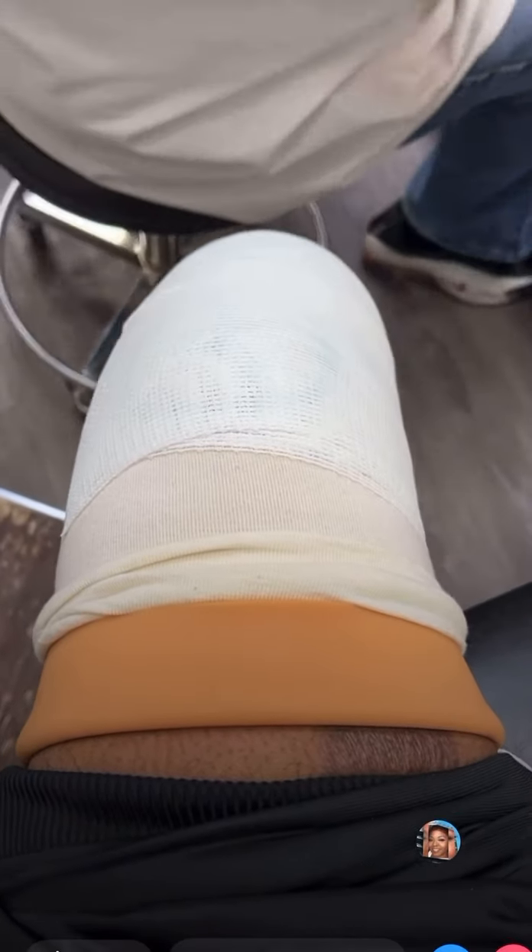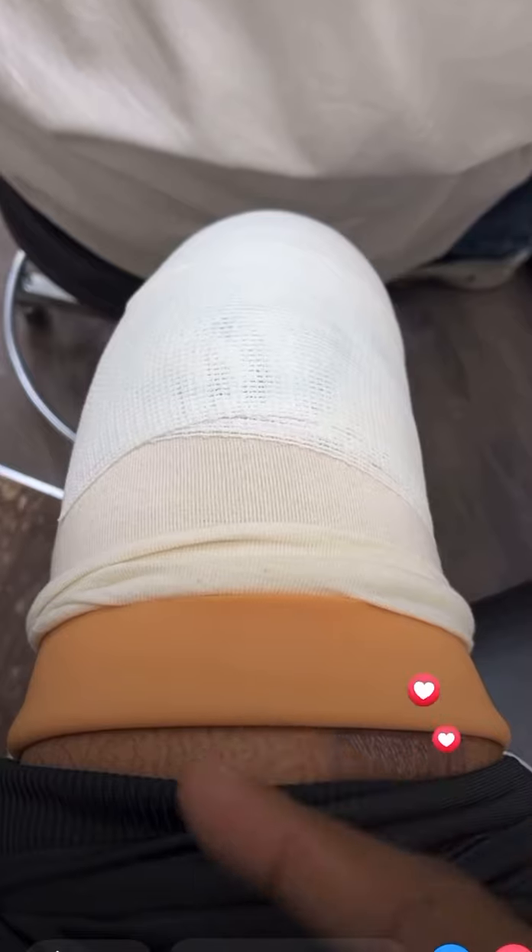So what this is — it's like a cast, and you know when a woman is pregnant and they like to get the measurements of the stomach? He was actually outlining the bones — the different bones like the knee and the side and the front — to make a better quality socket. The casting is to get the sizing of the stump that the socket needs to actually be, and not like this with all this space.